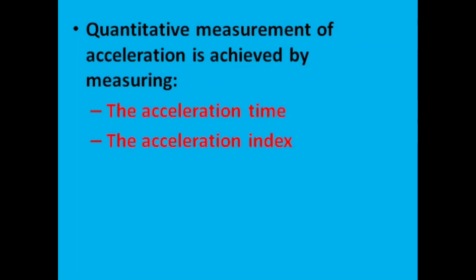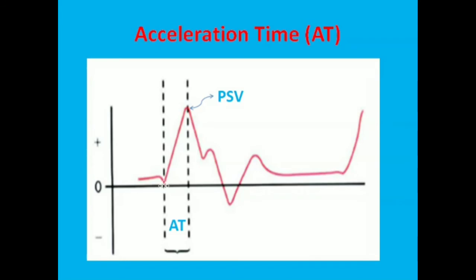Quantitative measurement of the acceleration is also possible. We can measure the acceleration time and also we can measure the acceleration index. The acceleration started from here and achieved a peak systolic velocity. The time taken from here to here is shown here.